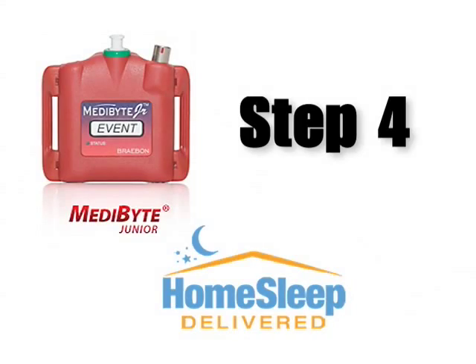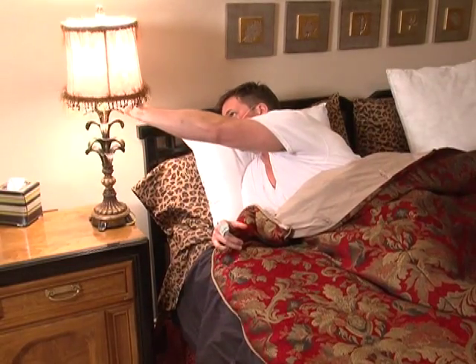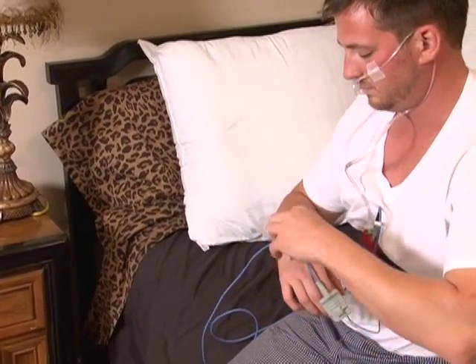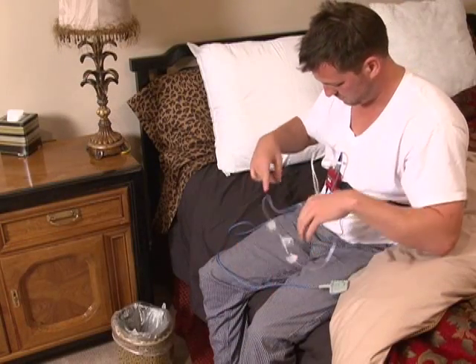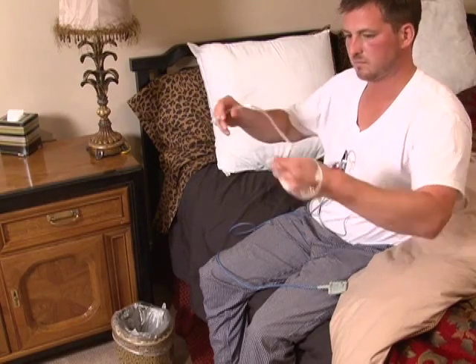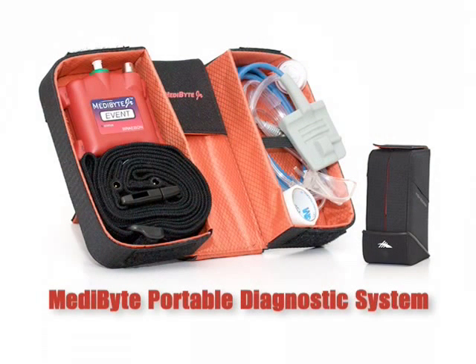You are now ready to go to sleep. If at any time during the night you need to go to the restroom, don't worry — you don't need to turn off the unit. It will continue to operate as programmed. When you awake, simply disconnect the sensors from the unit, disconnect the unit from the belt, and return all pieces of the unit to the package, except for the nasal cannula, which can be discarded. Return the packaged Metabyte system according to the instructions you were given.